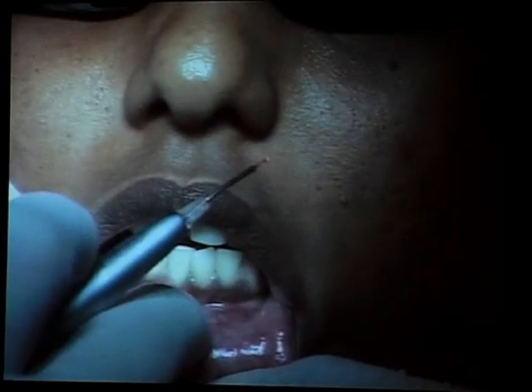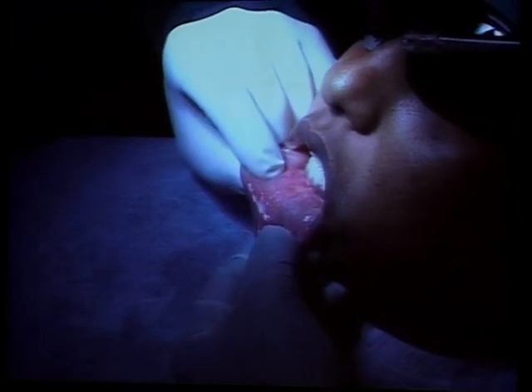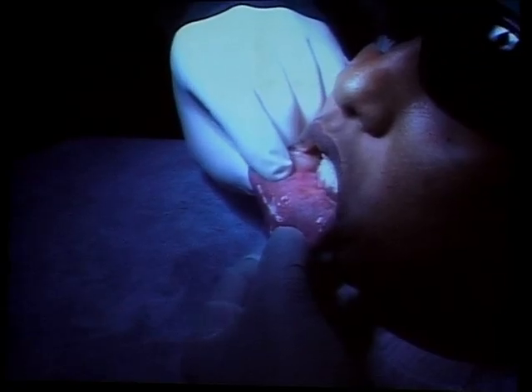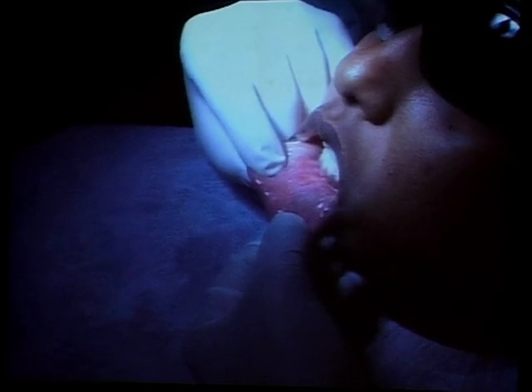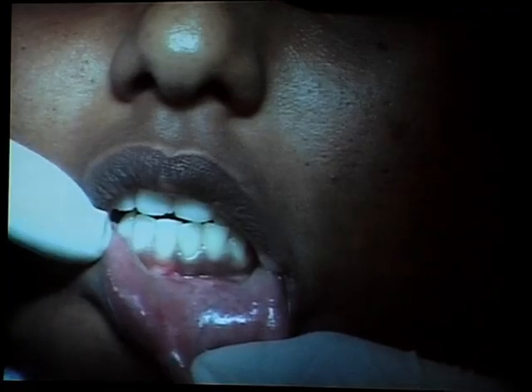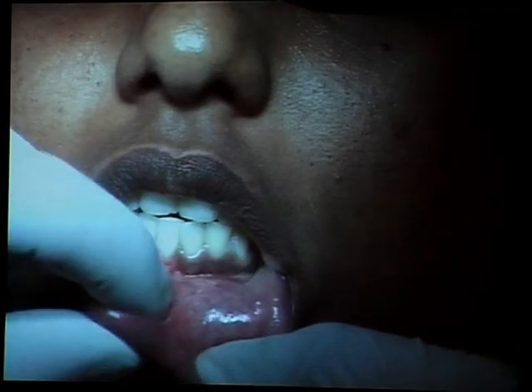There are other methods of gating your laser handpiece as well. One is by going into contact, non-contact, contact, non-contact, and keep on moving the laser. That's one of the other ways of doing it. Once you do the programs and get used to it and start treating patients, you'll understand what I'm saying. Frenulum has gone. That's better.